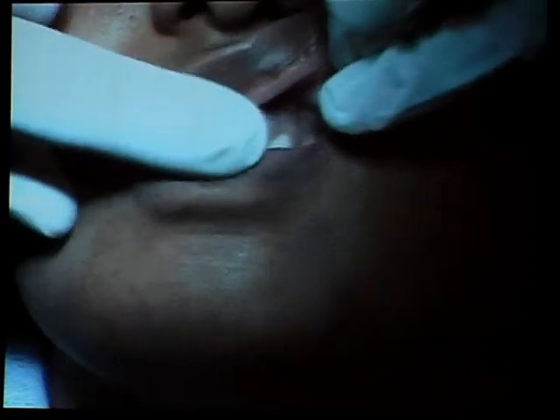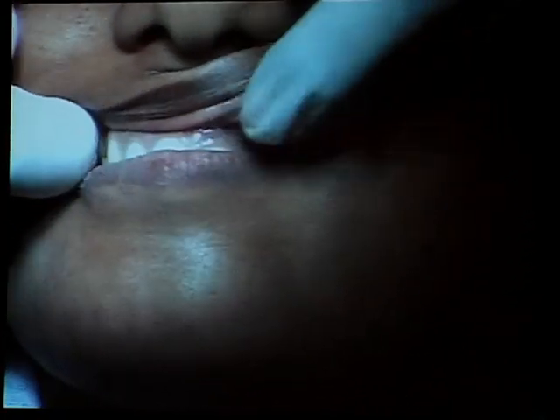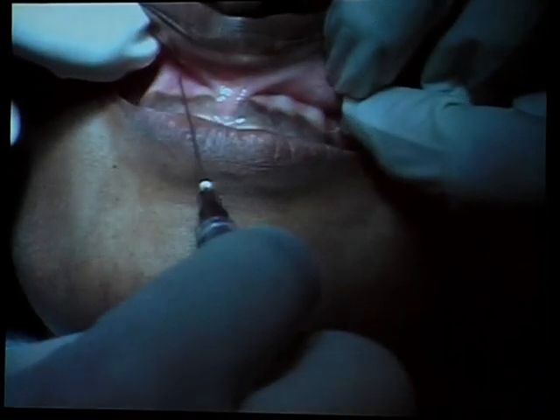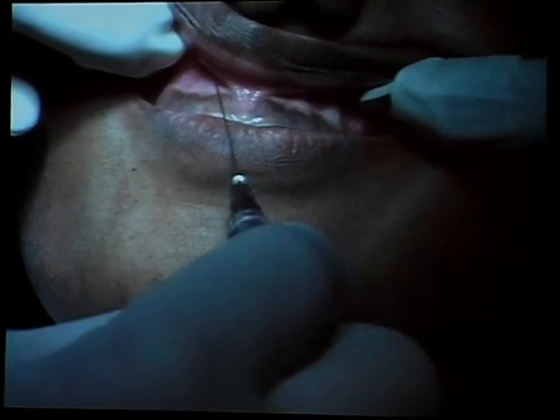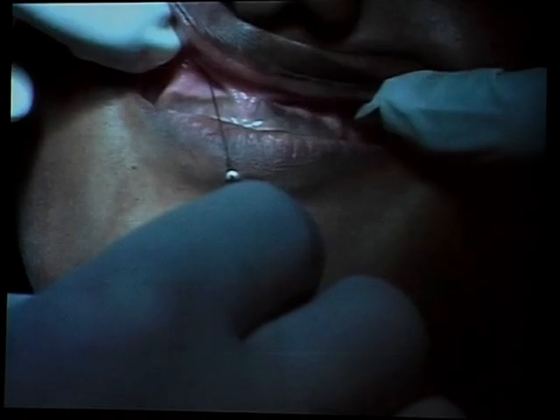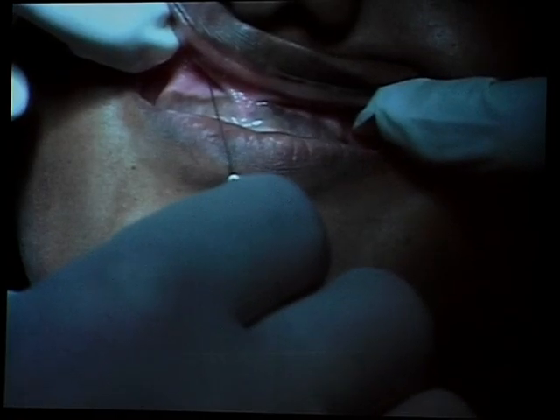If you have to put this patient under anesthesia for a procedure like this, that would be dental terrorism. That's what I call it, because you have such a simple methodology of doing it. Why are you not doing that? Ralf is being very conservative by anesthetizing. I would have done it without.